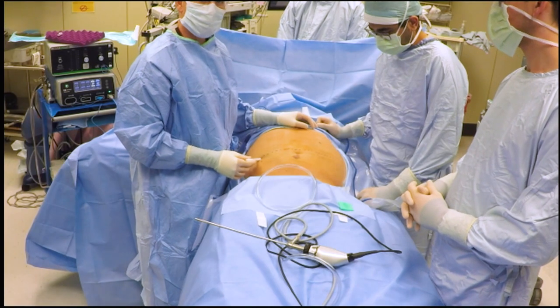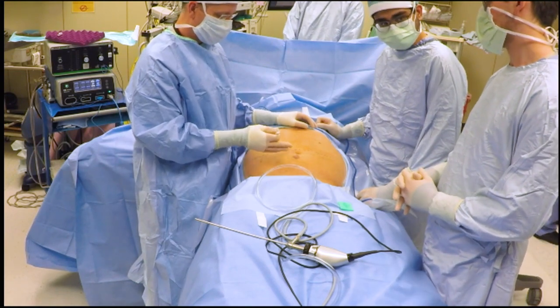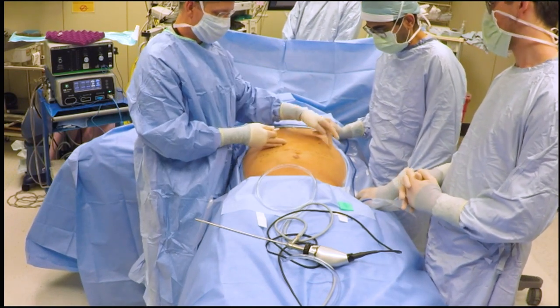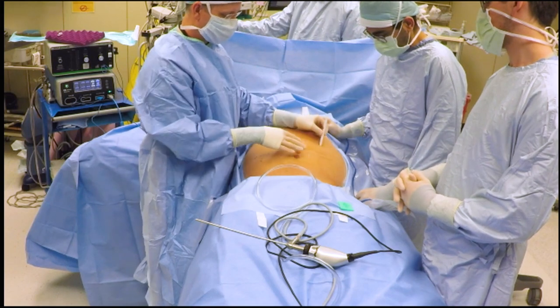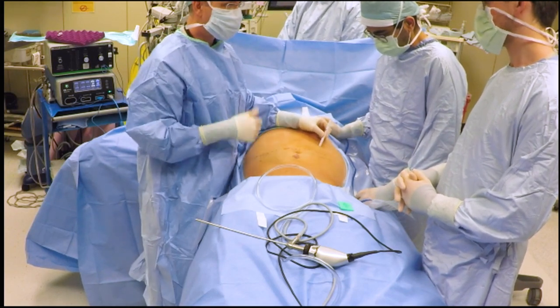Based on patient preference, as well as the patient's beltline, it is determined preoperatively that the exit site for the catheter will be in the left upper quadrant of the abdomen.